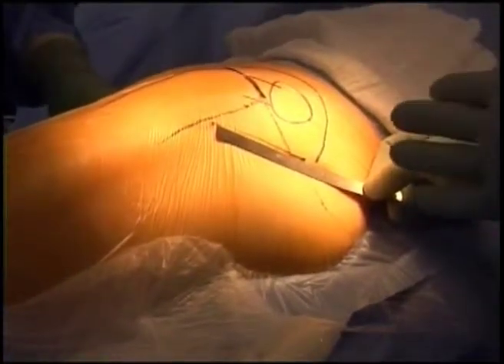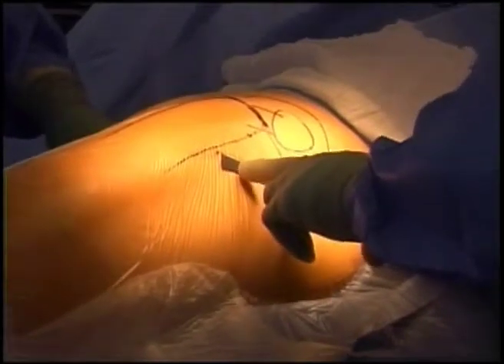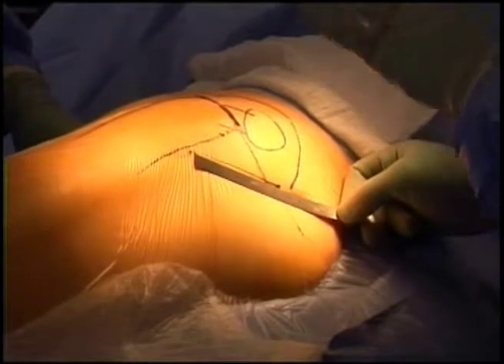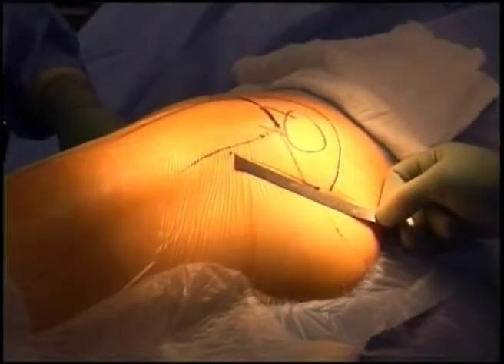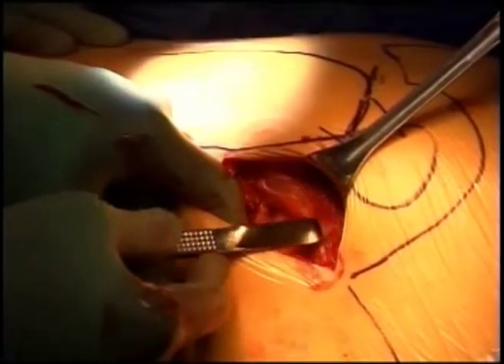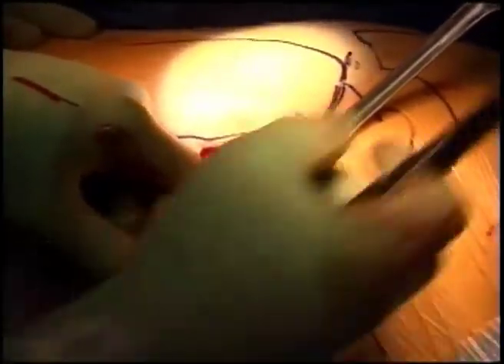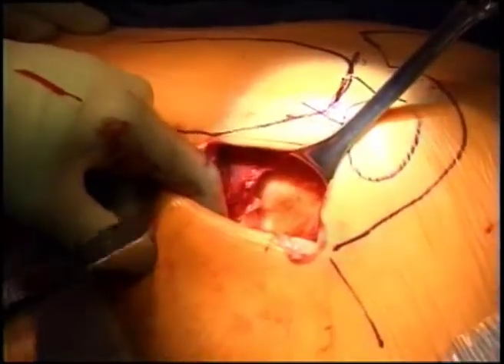For this minimally invasive surgical approach, we use an approximately three-inch incision over the upper portion of the buttock. You'll see us set down through the skin and the gluteus or buttock muscle until we reach the deeper layers of the hip. Here we've created the skin incision and come down through the subcutaneous tissue. This red fiber tissue is the gluteus muscle, and underneath it you can see the deeper structures of the hip.